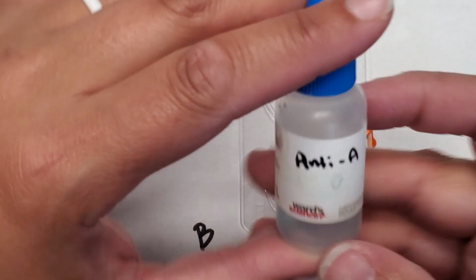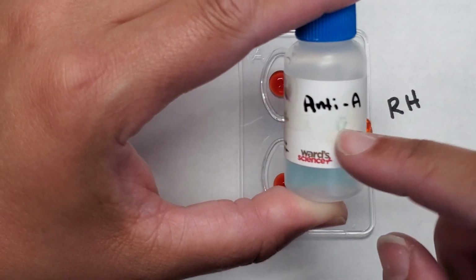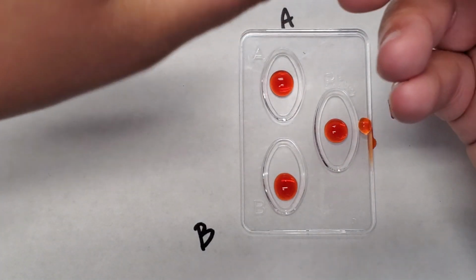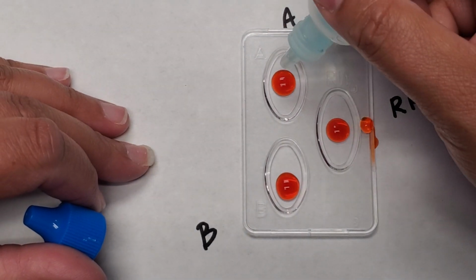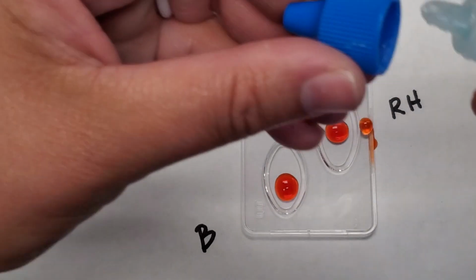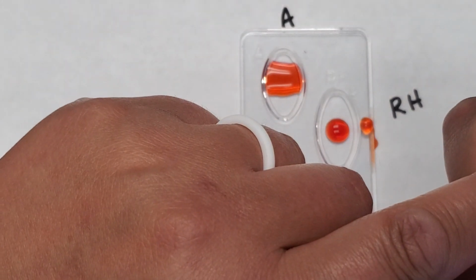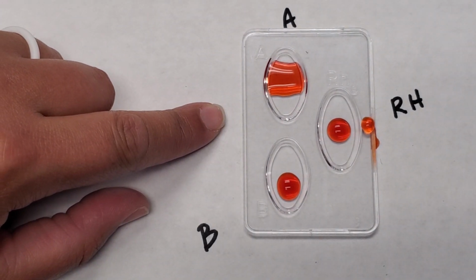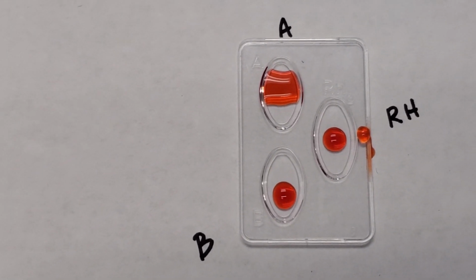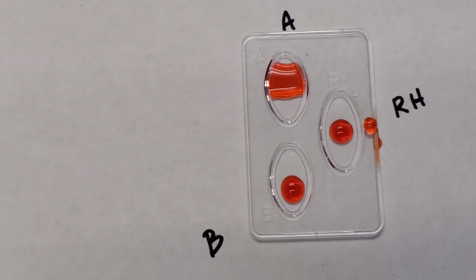The first antibody that we have in this blue bottle is anti-A. So this is antibody A. We're going to mix it with the A well, okay? What this antibody does is try to attack the antigen to see if it is present. So antibody A attacks antigen A and it causes agglutination or clumping. It can also look like a gel-like fluid. It can also cause a crystal structure to appear within the blood.